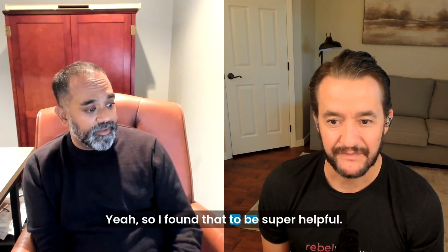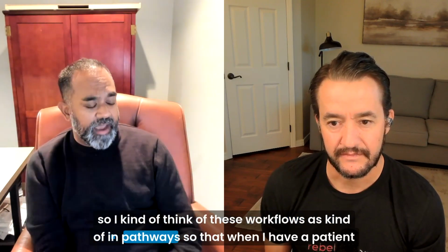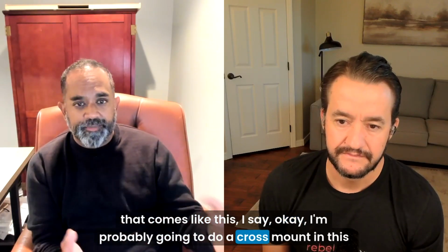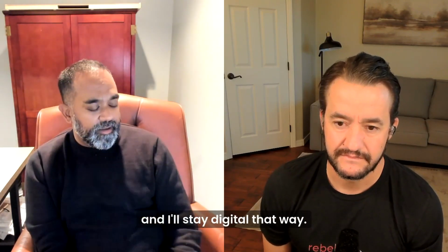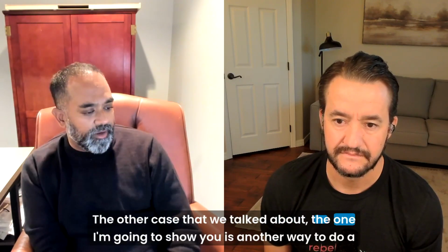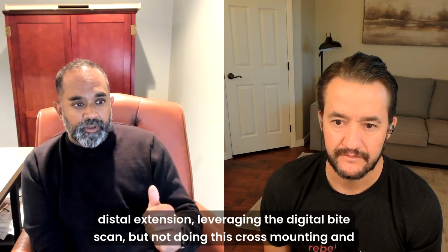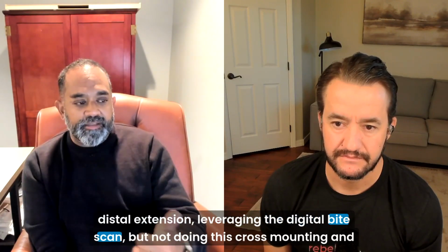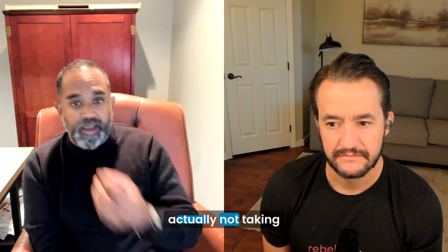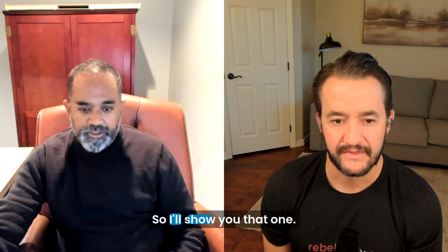Yeah, so I found that to be super helpful, and so I kind of think of these workflows as pathways, so that when I have a patient that comes like this, I say, okay, I'm probably going to do a cross mount in this, and I'll stay digital that way. The other case that we talked about, the one I'm going to show you, is another way to do a distal extension, leveraging the digital bite scan, but not doing this cross mounting and actually not taking a full impression and not using a stone cast. So I'll show you that one.